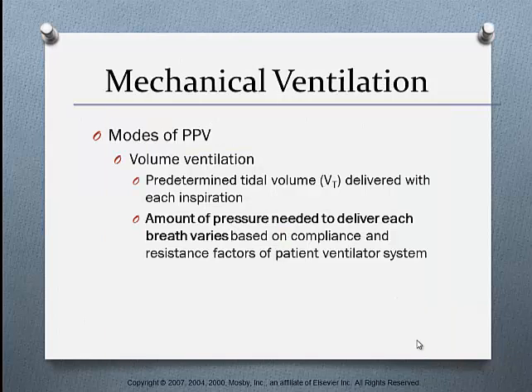Modes of PPV, we have volume ventilation. It's a predetermined tidal volume delivered with each inspiration. The amount of pressure needed to deliver each breath will vary based on the patient's lung compliance and resistance factors of the patient ventilator system.